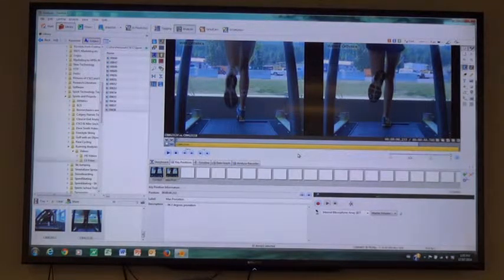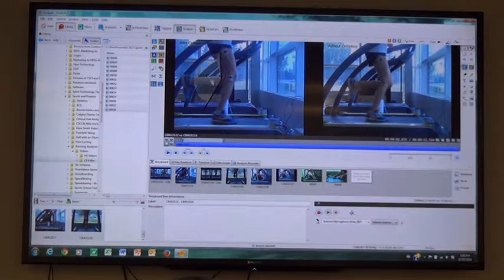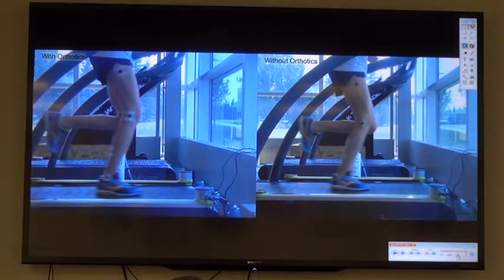and her issues have subsided. You can see on the side view actually, the muscles seem to fire far more without the orthotics. Like there's more muscle work visually. Kind of interesting. So let's talk about some of these things, so we have with and without orthotics, and let's just watch the video.